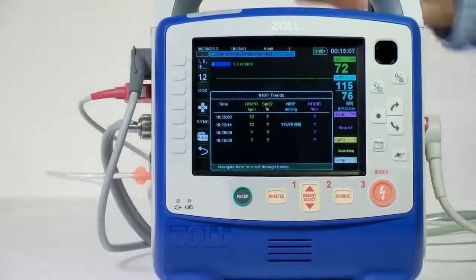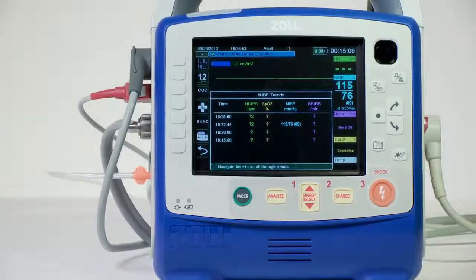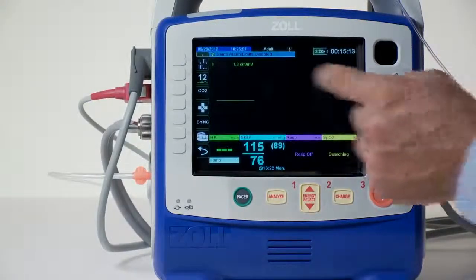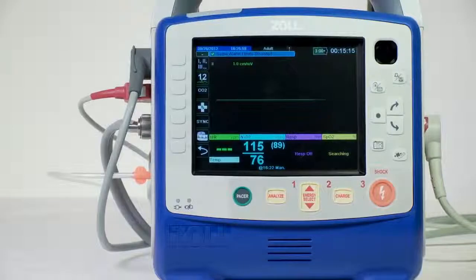accumulate in the adapter. The smart capno line nasal and nasal-oral cannulas are intended for monitoring CO2 in non-intubated patients. Oral nasal sampling cannulas are especially valuable for patients who are prone to mouth breathing, since most, if not all, of the CO2 is exhaled through the mouth.